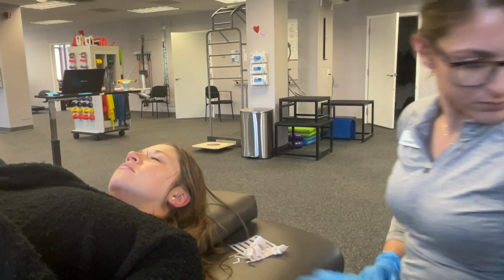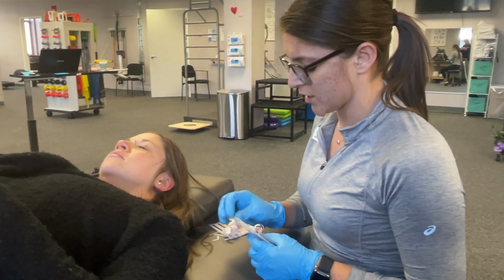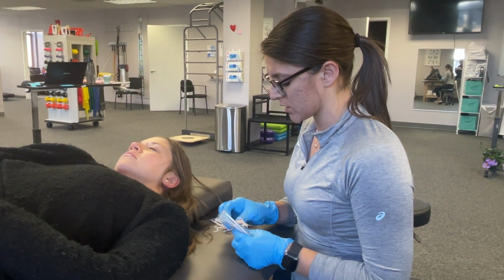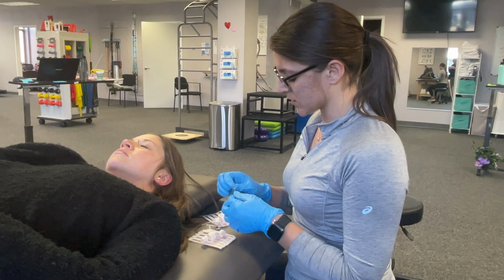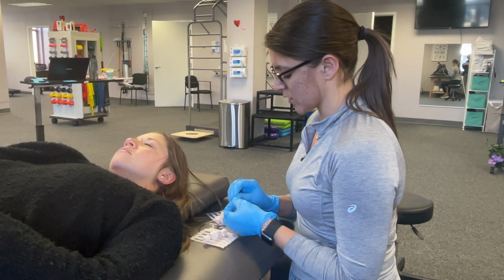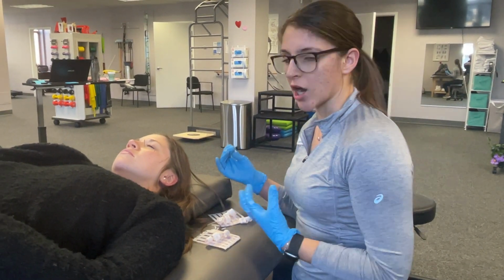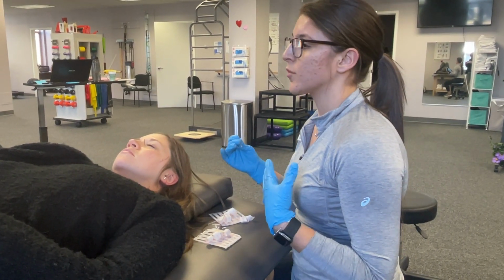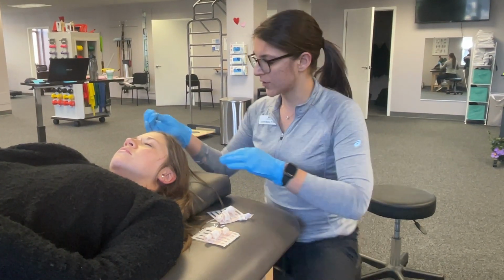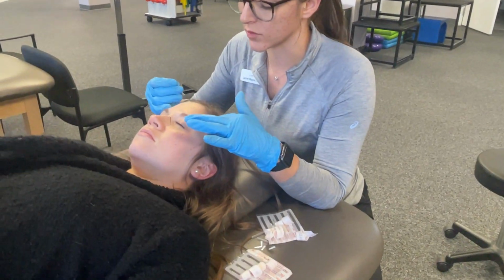Good. So another component of this treatment that we're not going to demonstrate in this video is that we would also be placing some needles into her cervical spine along the suboccipital region and along the transverse process of C2 to further help target her autonomic nervous system and promote greater homeostasis. For now, we can go, say she has some headaches associated along the frontalis muscle here.